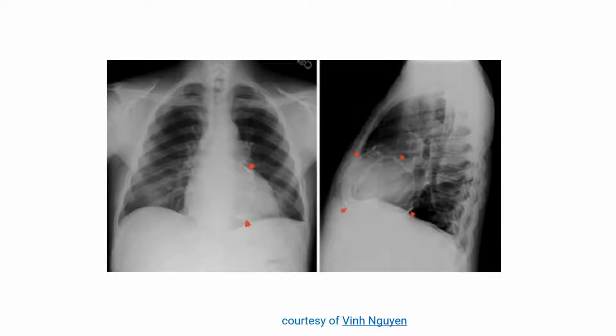We will do echo. Yes, exactly. For any pericardial calcification, this much, you ought to order echo. Why should I bother? Because echo might reveal constriction physiology way ahead of clinical manifestation. So don't rely on clinical manifestation alone. Don't assume that if I don't have clinical constrictive pericarditis, I'm not going to bother. No, you have to be proactive.